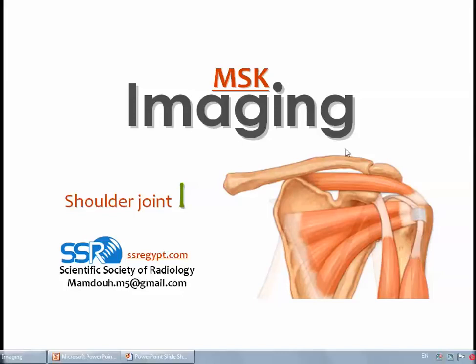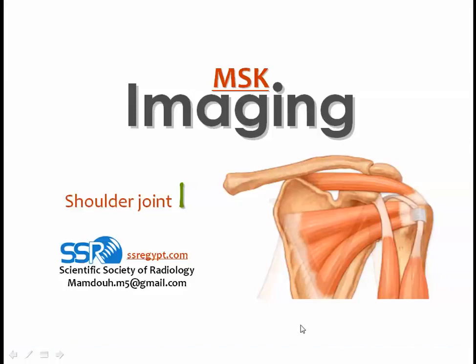Dear colleagues, in this talk we'll handle one of the important issues in musculoskeletal imaging, which is the imaging of the shoulder joint. Imaging of the shoulder will be handled in 3 talks, starting in the first one with the normal anatomy and techniques. Then we will handle the imaging of the rotator cuff and the impingement syndrome. And in the last section we will handle instability and SLAP injuries.